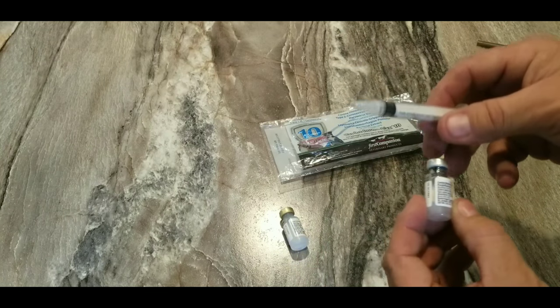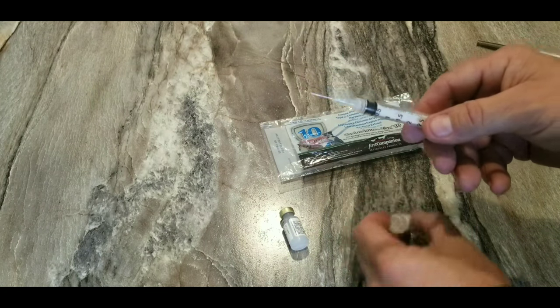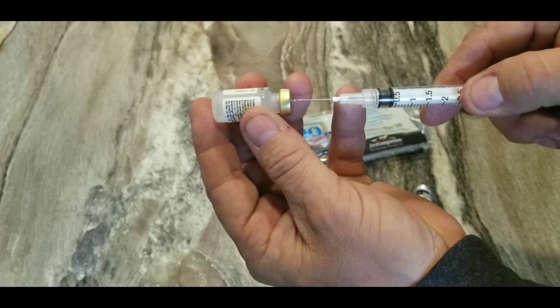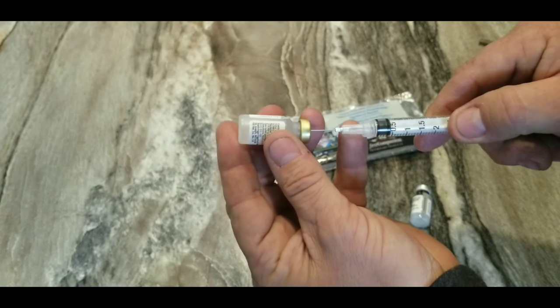We don't reuse our needles in the world, but this is a family of dogs and I'm lazy. So I'm probably going to reuse these needles on each dog.